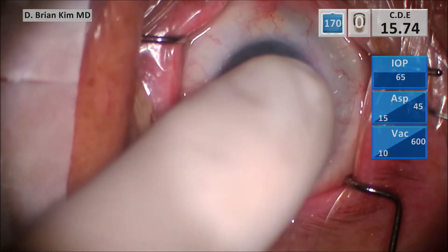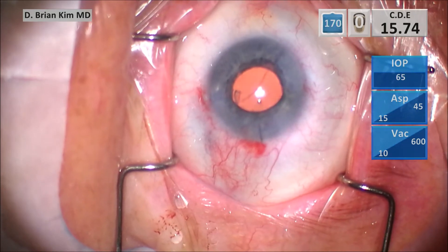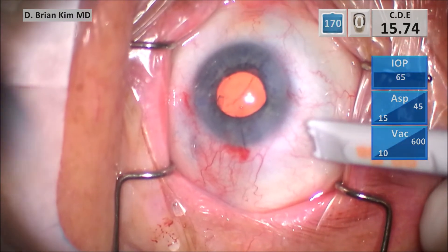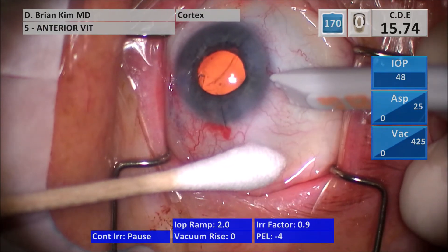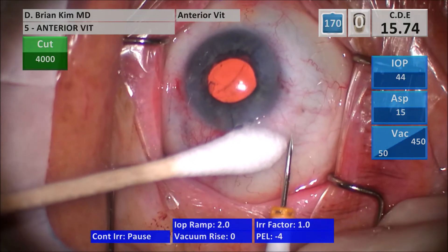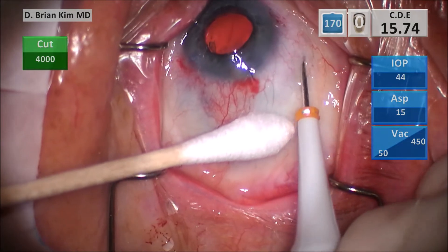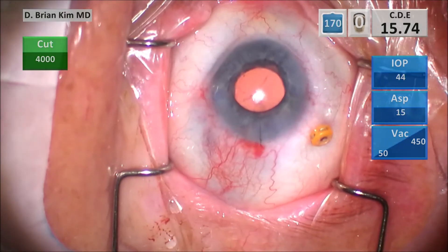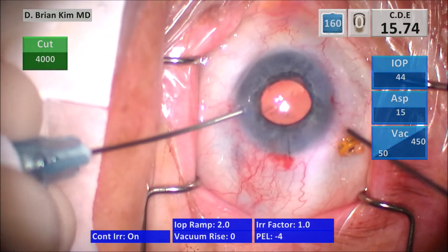The lens-iris diaphragm came forward and now I have a shallow chamber, so I'm going to go ahead and do a pars plana vitrectomy. I have filled the eye with BSS, I have a firm globe, and I've sutured my wound. I indent the sclera with the back side of the trocar, tunnel about three millimeters from the mark tangentially, making a nice scleral tunnel, then dive down perpendicularly. This is my AC cannula — it's a 20-gauge AC cannula.